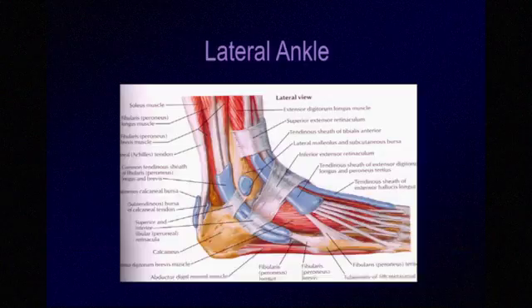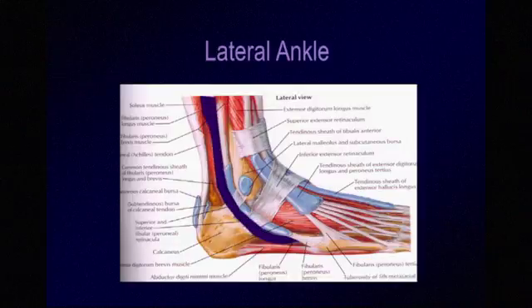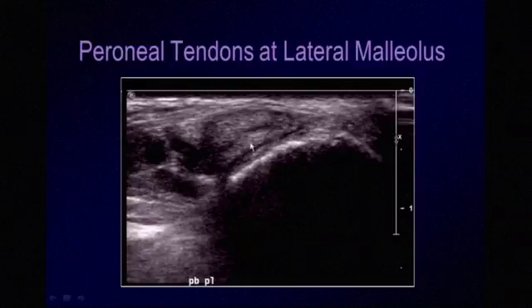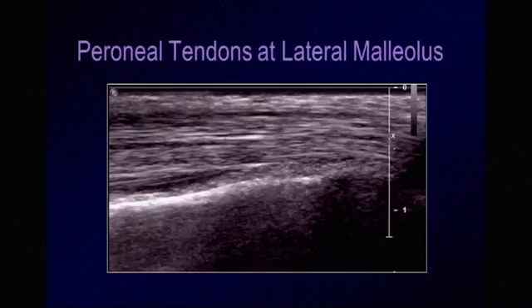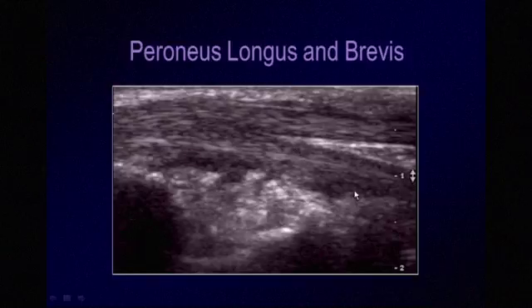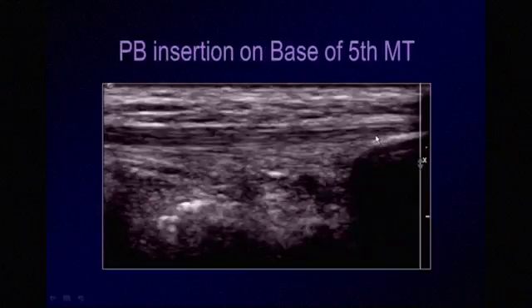Moving on to the lateral ankle, we are looking at the peroneus longus and peroneus brevis tendons. At the lateral malleolus on the axial view, a helpful mnemonic: the brevis is against the bone (B, brevis, bone), and the longus sits superficial or lateral to the brevis tendon. On the long axis view, the tendons are uniformly hyperechoic with fine fibrillar echogenic lines. Distal to the malleolus, the longus and brevis diverge — the longus dives deeper around the foot while the brevis extends to its insertion on the base of the fifth metatarsal.